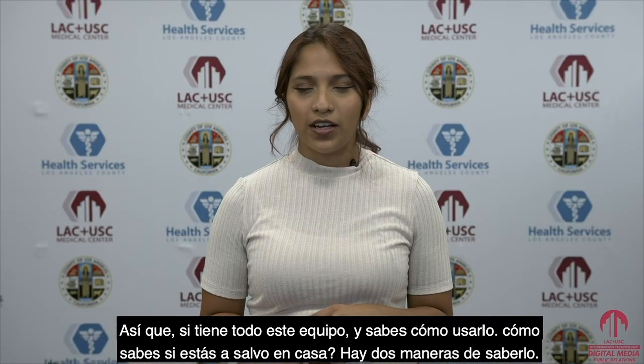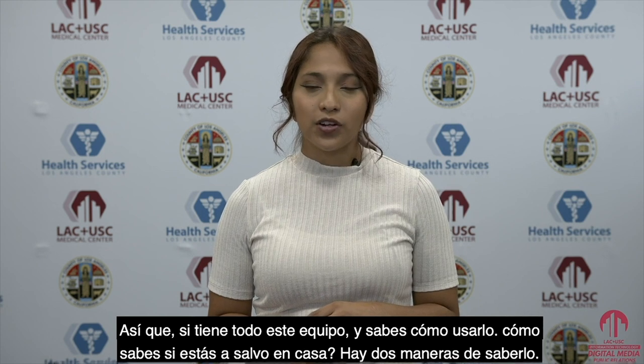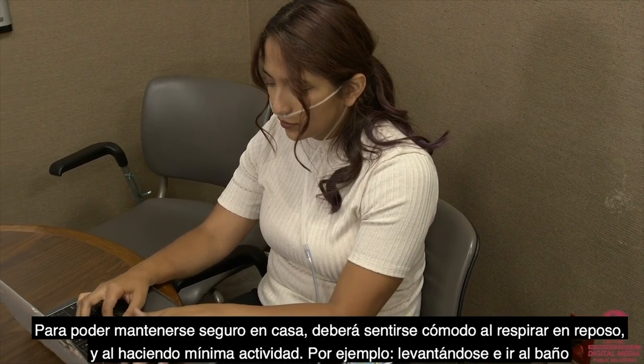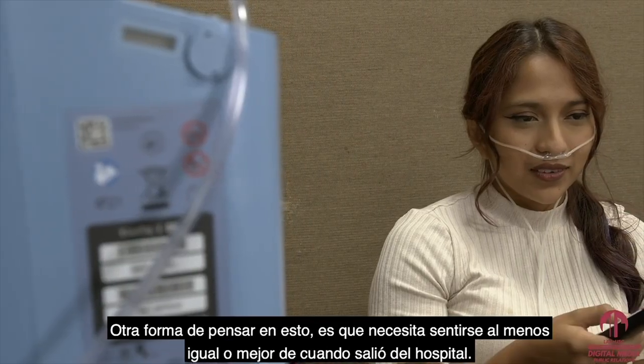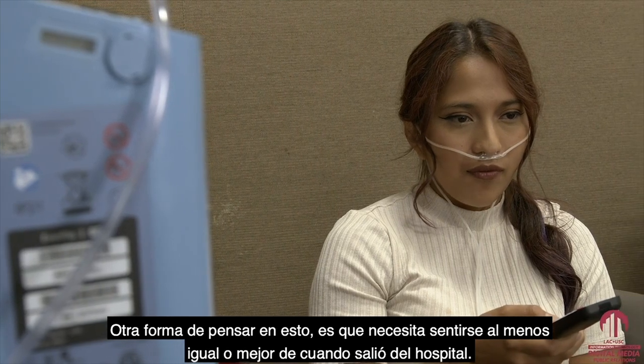So if you have all this equipment and you know how to use it, how do you know if you are safe at home? There are two ways to tell — the first being how are you feeling, and the second, what are your numbers? In order to be safe at home, you need to feel comfortable breathing at rest and with minimal activity, for example getting up and going to the bathroom. Another way to think of this is that you need to feel at least the same or improved since you left the hospital.